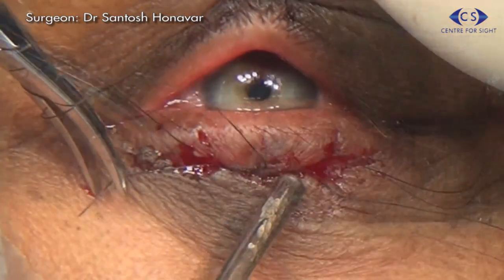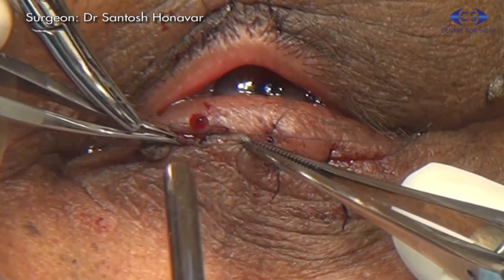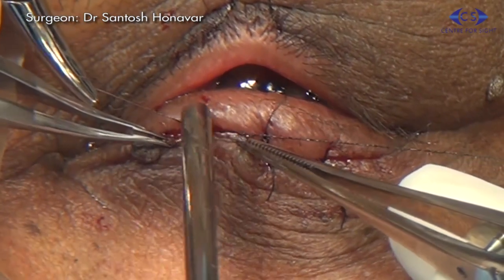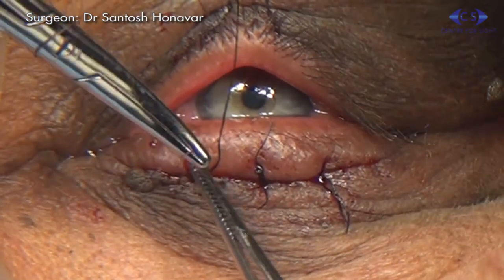The endpoint is just adequate correction. There should be no overcorrection on the table, especially medially, to minimize the risk of punctal eversion and consequent epiphora.